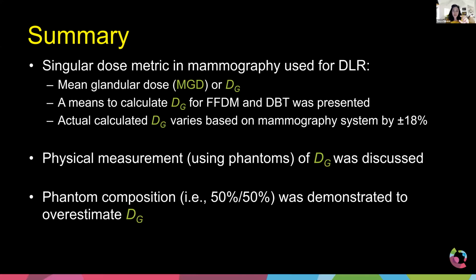So are you trying to say that 18% is like a buffer zone for the filter, for the vendor specific, and for the formula, which is like an acceptable area for the overall picture when we have the national dose? And if each hospital wants to go back and look at that technique specifically on the vendor, they need to call medical physicists and ask them to do the real measurement and dosing, and also look at the lookup table. But for the overall picture, we use 18% plus and minus to be like a buffer zone.